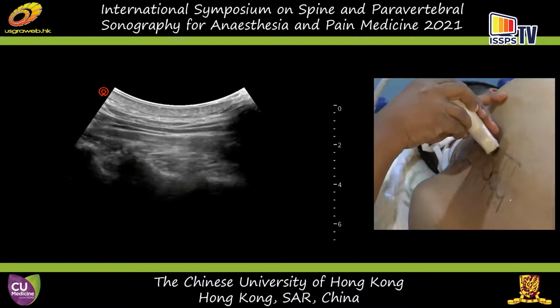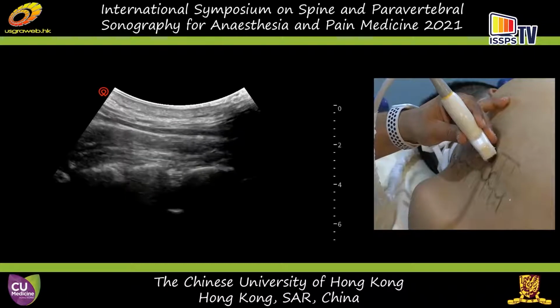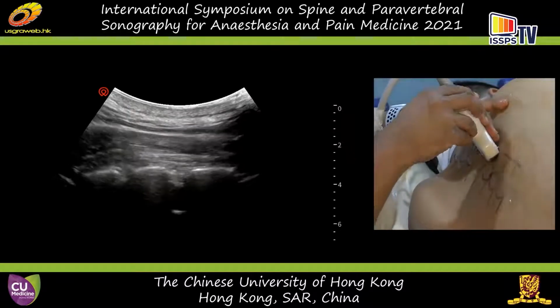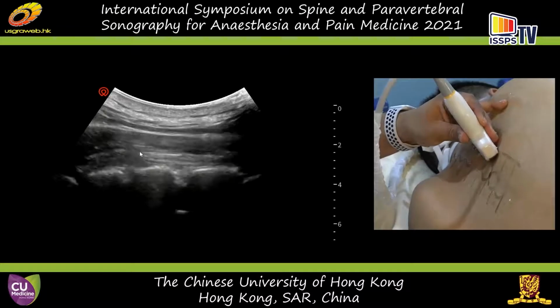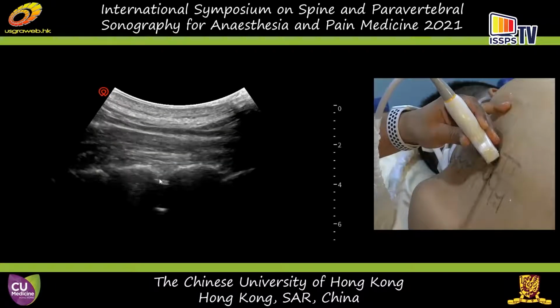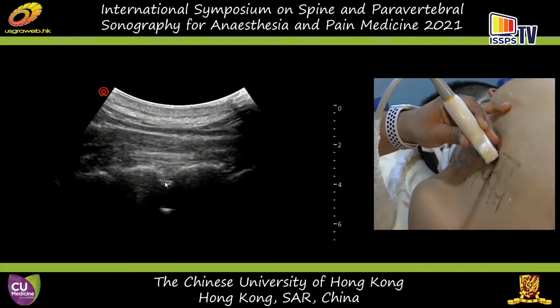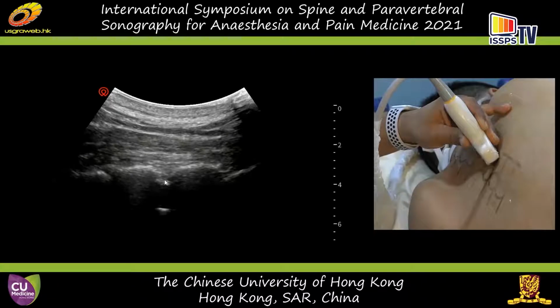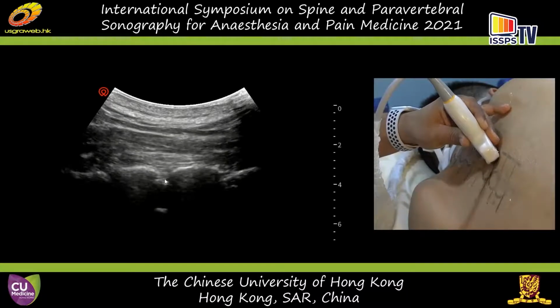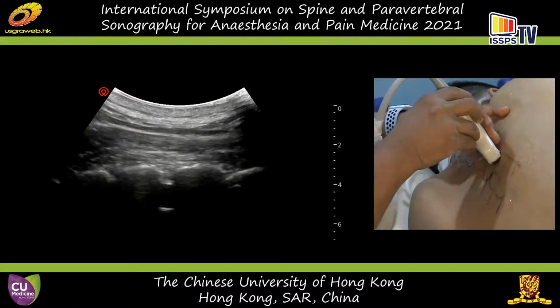it's very difficult. So we are now going to do the paramedian sagittal oblique view, as I alluded to before. You can see the lamina are quite flatter than the lamina in the lumbar region, and the acoustic window is quite narrow. But you can see the posterior complex with the ligamentum flavum, the posterior dura, and the epidural space, where the arrow is now. Just behind that, the lamina are posterior. Anteriorly, you can see the anterior complex, and the anechoic space is the intrathecal space, the spinal cord, and cauda equina, etc., which will be there at the lower level.